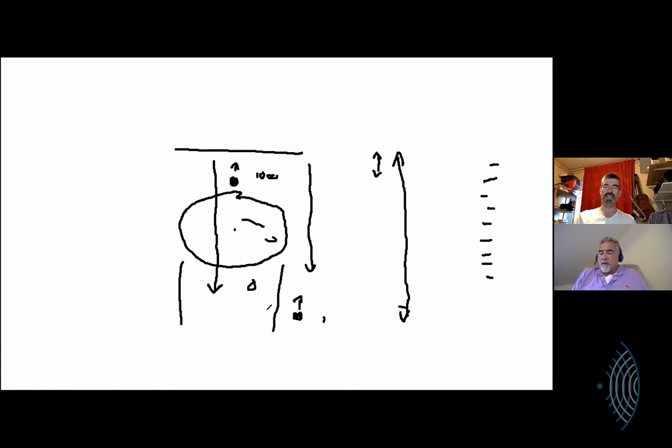And then you would increase the gain, but you wouldn't necessarily want the front of the picture also bright, because you can just increase the brightness of the whole picture. But if you want to have a comfortable picture to look at, you actually want to be able to change it, and this is known as time gain compensation. So that's what that is.